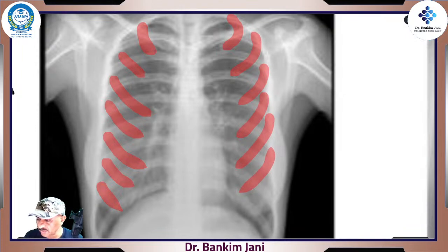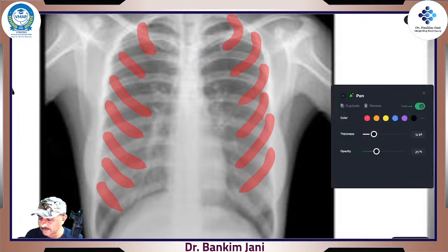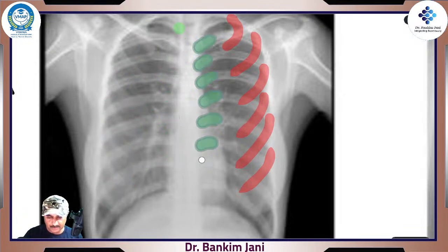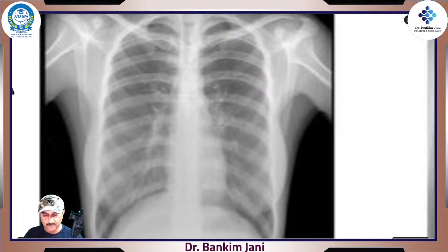What we are watching over here, these are posterior ends, right? The posterior ends which are related to the vertebra, right? These are the posterior ends. Clear? Now let's erase all of them and then see.